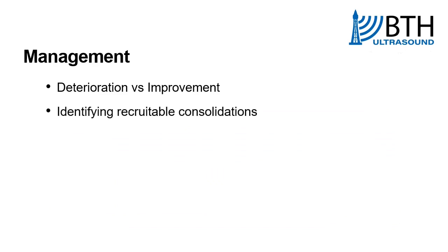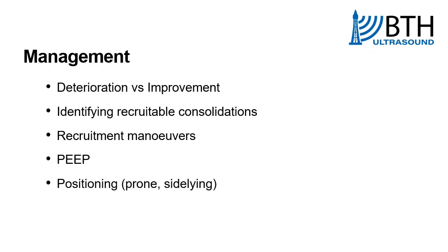You can also use it to identify recruitable consolidations. Like I've said before about other pathologies, maybe some of these consolidations do have the potential to be recruited, and it would be good to use ultrasound to identify those or see how they respond to recruitment, either through recruitment maneuvers, PEEP titration, and prone positioning or side lying, with regards to trying to increase the expansion and aeration of any particular consolidations identified.